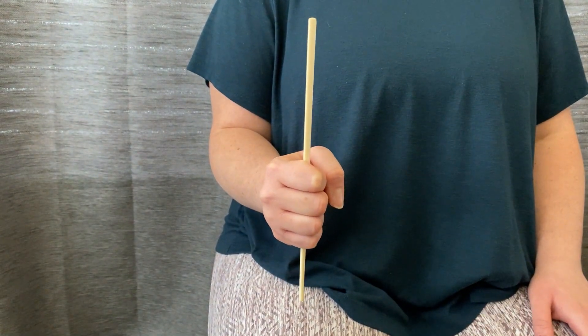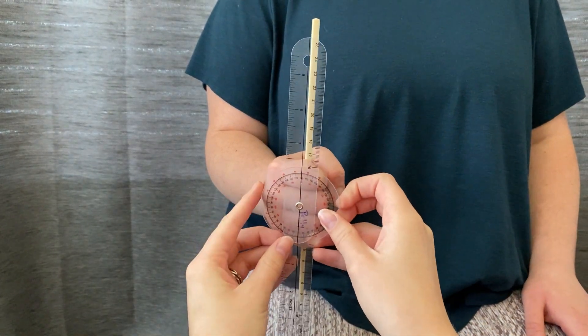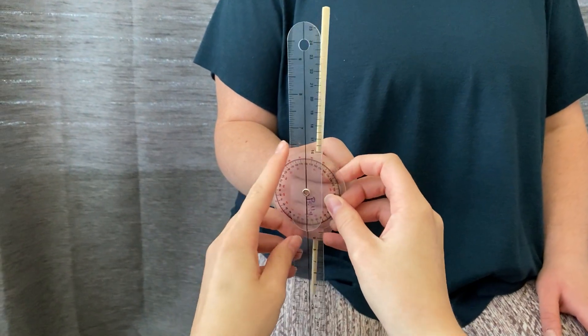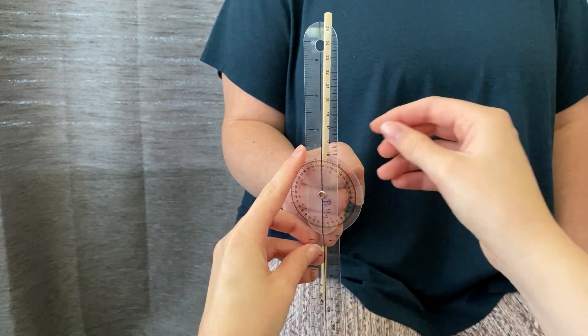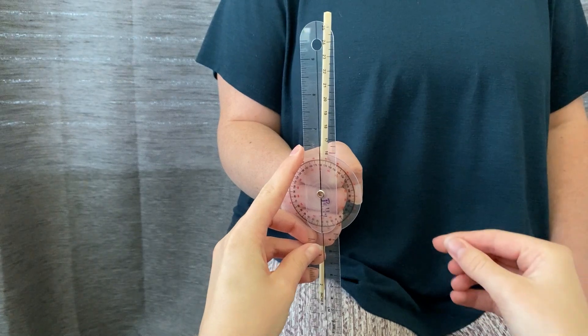The axis placement of the goniometer is going to be between the MCP joint and the PIP joint of the middle finger. The goniometer is going to start open and the stationary arm is going to be perpendicular to the floor, and the movable arm will begin pointed at the ceiling and it'll move with the object into pronation.